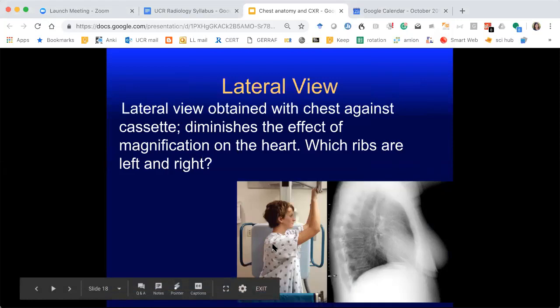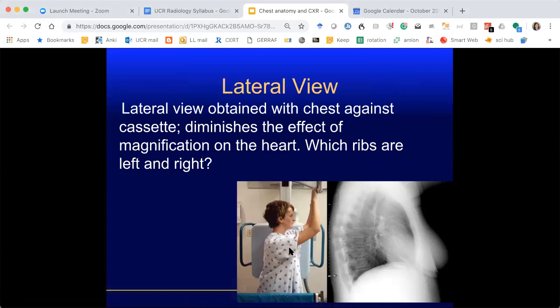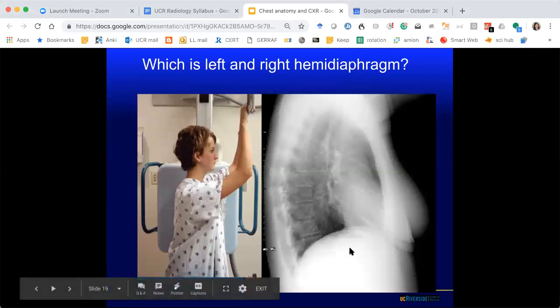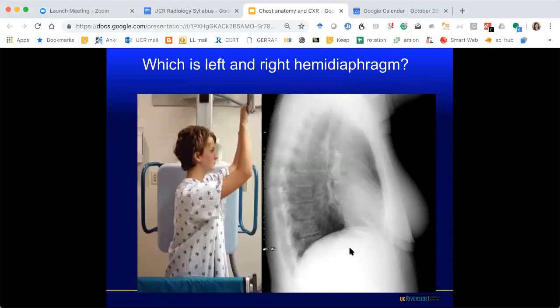The closer the flashlight is to the detector or the wall or the garage door, the crisper the image, the better the resolution, but the smaller the image. So there is that known effect that we see with radiology, and you can use it to your advantage because you know the spatial relationship, you can then help localize the abnormality if need be.